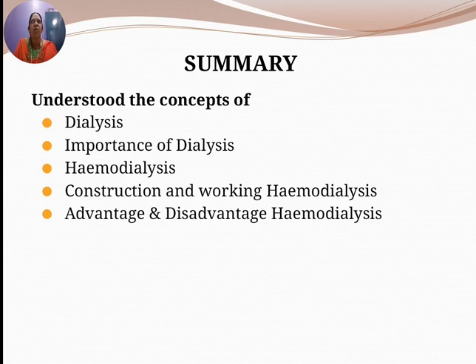Waste products accumulate in the body and become toxic; they poison the body and damage the other organs. So removal is compulsory. So dialysis performs the function of the kidneys if they have failed. It is a treatment that filters and purifies the blood using a machine.